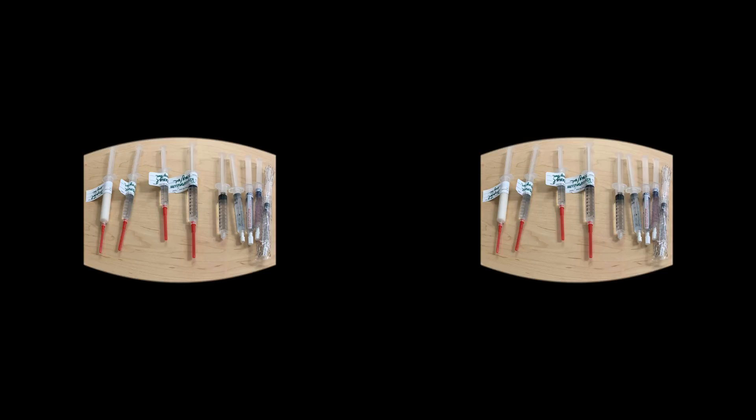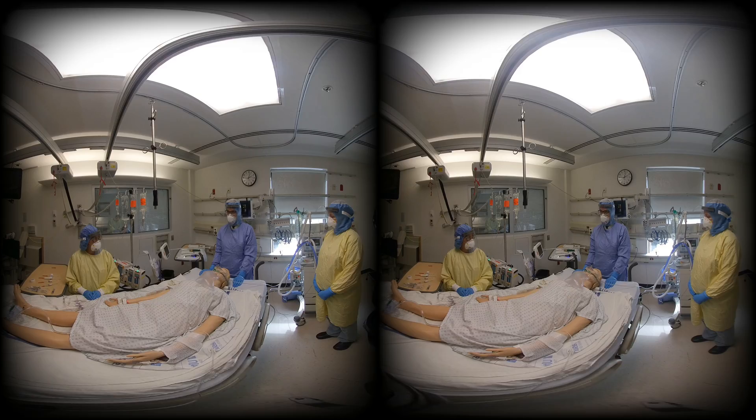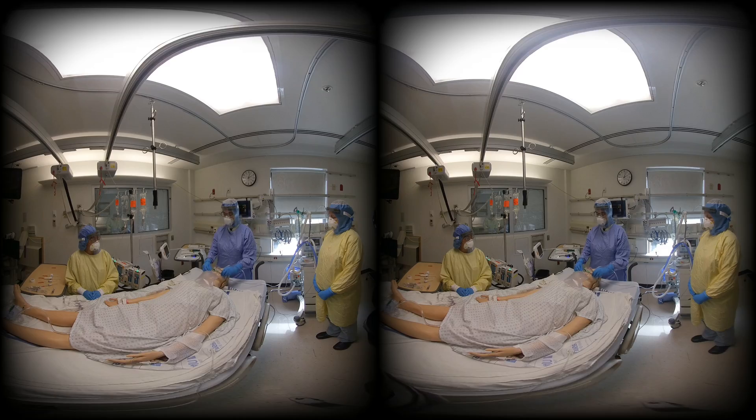Dosing for fentanyl, ketamine, and rocuronium will depend on the patient's weight. A standard list of equipment is outlined in the Edmonton Zone Emergency/Critical Care Intubation Checklist, and includes a GlideScope with a 3 or 4 blade, an endotracheal tube pre-loaded on a lubricated rigid stylet, a flexible stylet, a syringe for inflation of the cuff, a laryngoscope, an NG tube with tape, and a bougie.